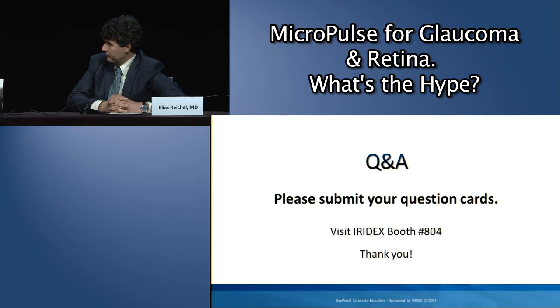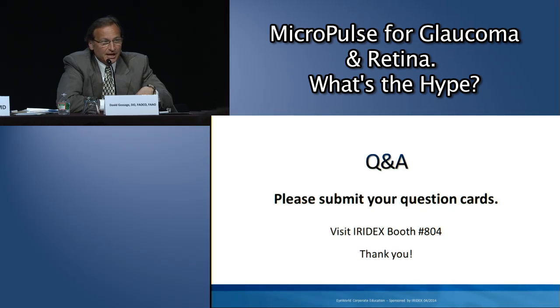The next question was, can you use it for treatment of central serous retinopathy? And the answer is yes. It has been used and applied for central serous retinopathy, and you do see beneficial effects in CSR.